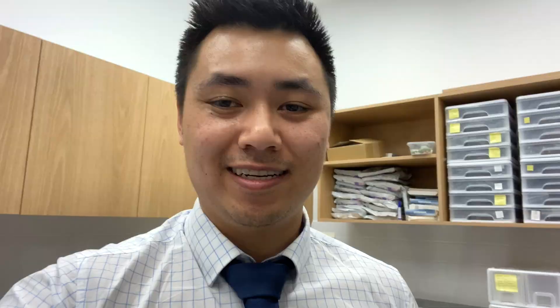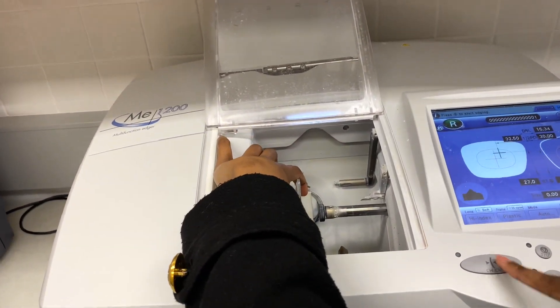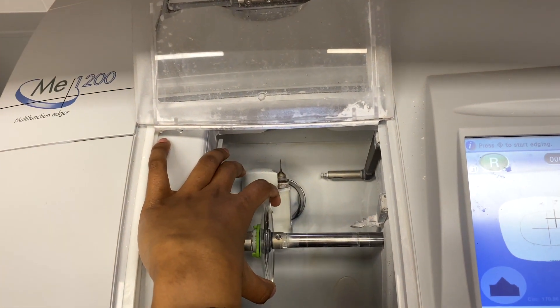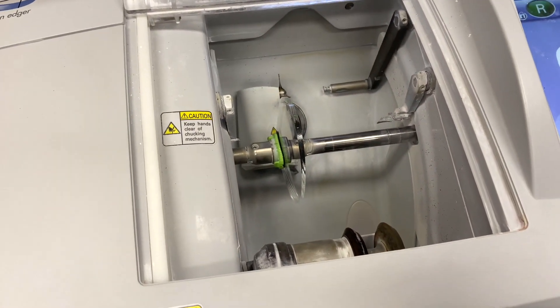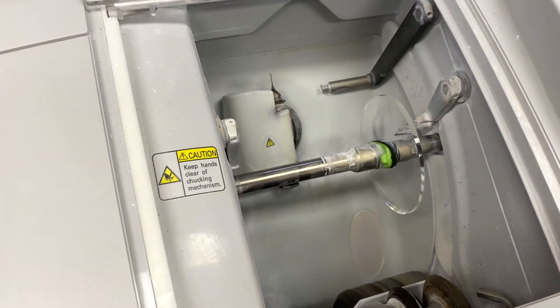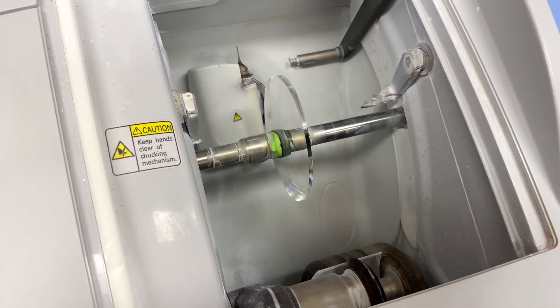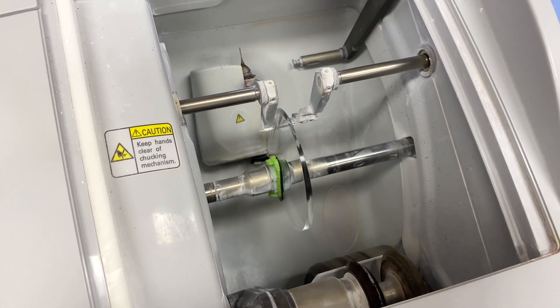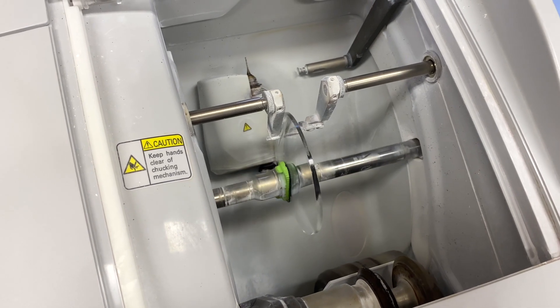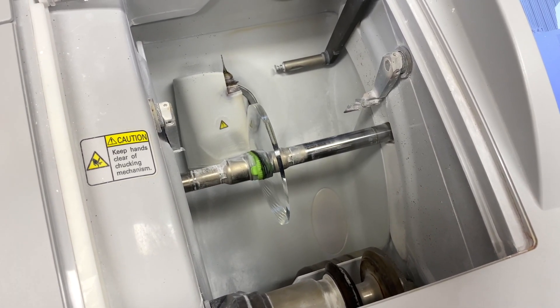Now it's time to cut the lenses — the most exciting part. With the file transferred into the cutter, Sammy places the lens into the machine, which holds it in place, and presses down to start the process. The machine also measures the thickness of the lens to make sure there is enough material to fit into the frame. The process takes about one minute and forty seconds.